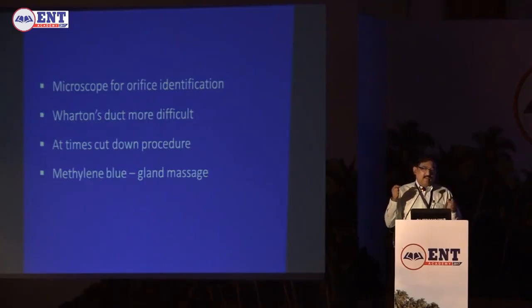So that is why in gastroenterology, the cricopharynx is a blind area. In the same way, in salivary endoscopy, the ostium is a blind area. As soon as you go in, you start irrigating with a lot of water. It's actually underwater. Your salivary endoscopy is done underwater.